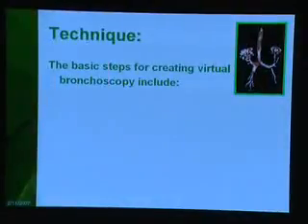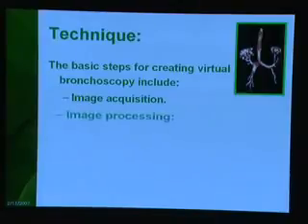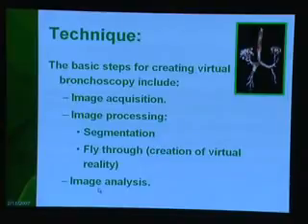The basic steps for creating virtual endoscopy include image acquisition. By image acquisition, we mean how to take the image, or how to examine the patient from the start. Then image processing, which includes two steps, segmentation and fly-through. Then image analysis, how to analyze the virtual endoscopy image, and image display.